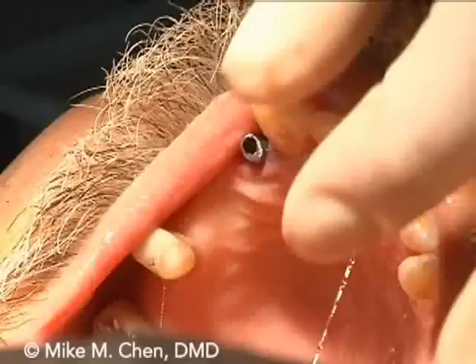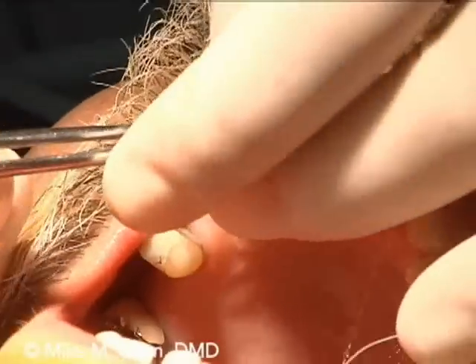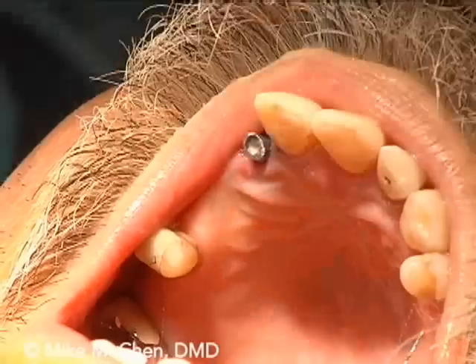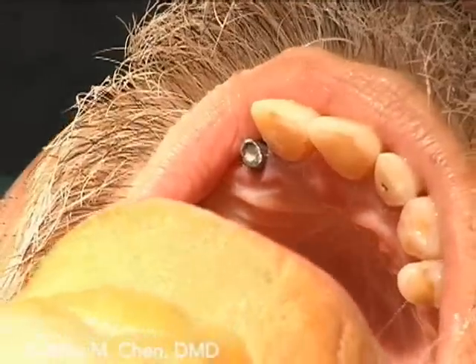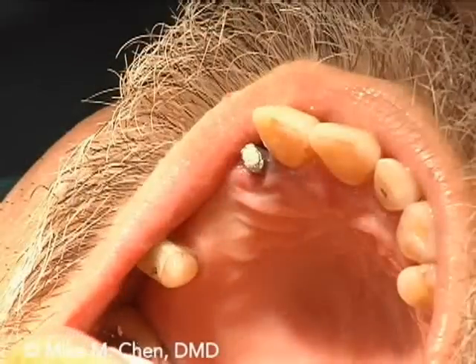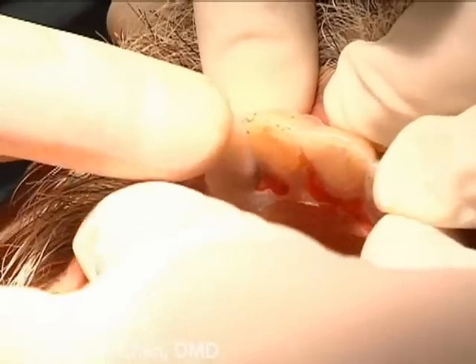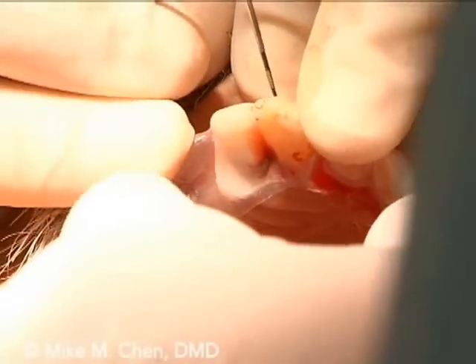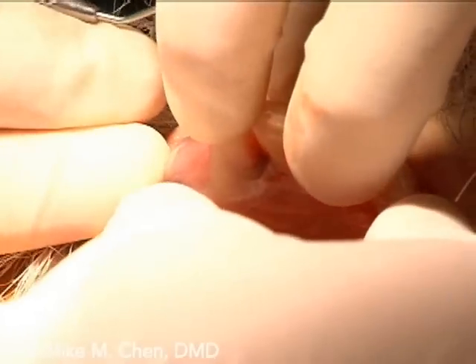Once the shaping is done, tissue looks good, and the area is cleaned up, place a little cotton in the screw hole, so we make sure we can retrieve it. And usually I just use some Cavit to cover the hole. And once doing so, place the acrylic temporary on top and do the adjustment. And the patient will have a temporary tooth there.